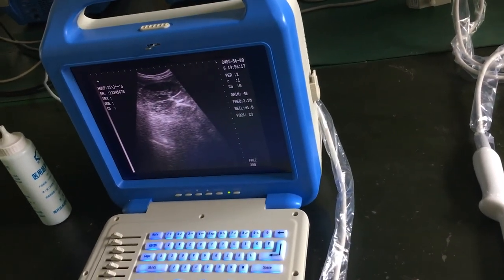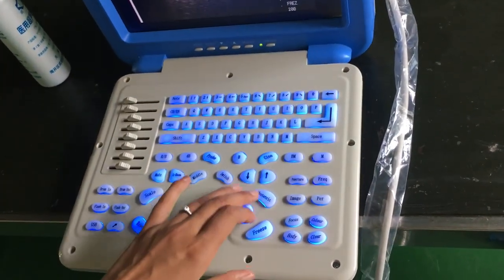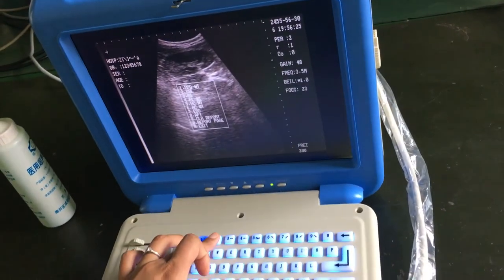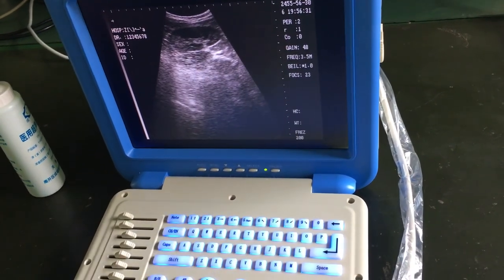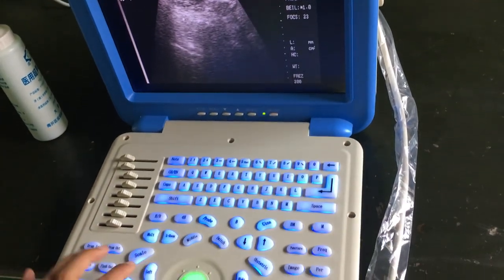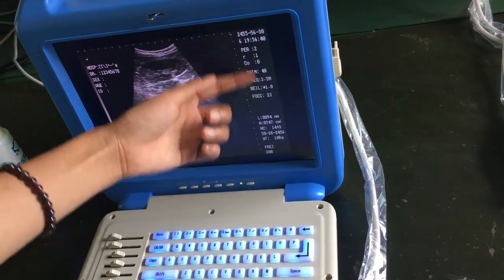Let me choose a function to show you how to use it. For example, Obstetrics — we press it, choose HC, press left, press middle, and press it again. We can then get the measurement result.